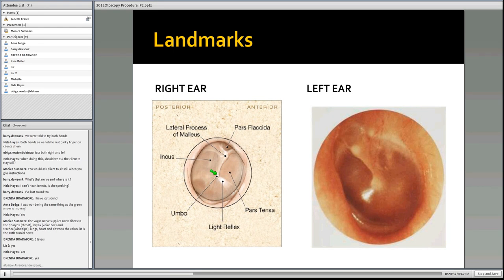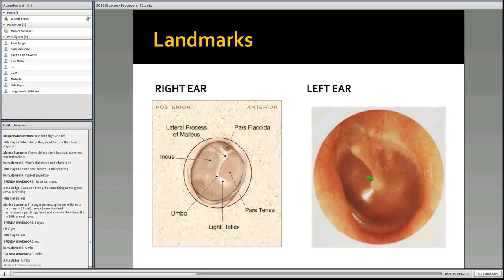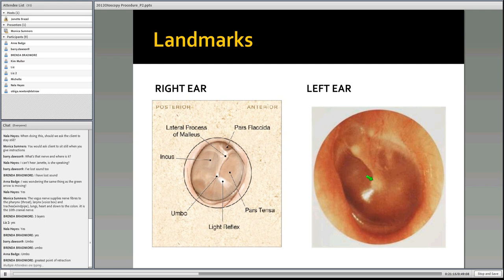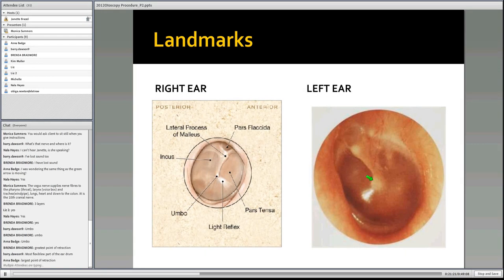If it's all broken up or it's not sitting in the right place, then something's abnormal about the eardrum that you're looking at. We can see here the nice handle of the malleus, and here's the point where the cone of light joins the malleus. What's that point called? Can anyone remember? The umbo, excellent. And what does the umbo signify? Greatest point of retraction, excellent. So that should be pretty much central. So that's good. And on here we can actually see a tiny shadow of the incus.